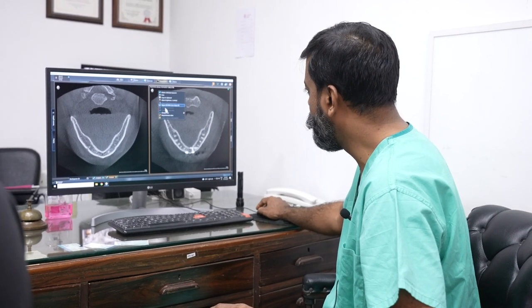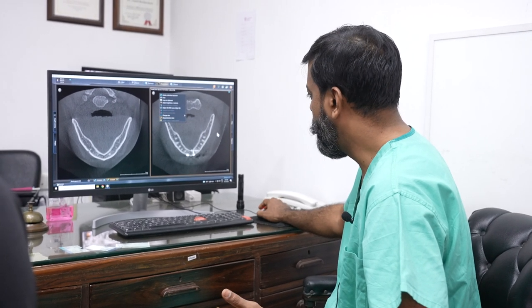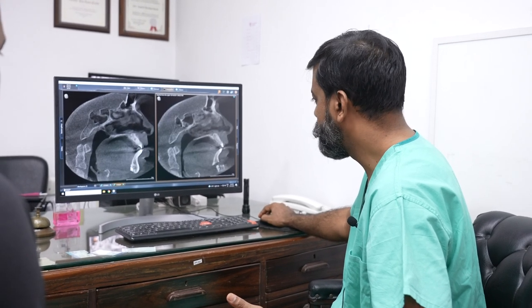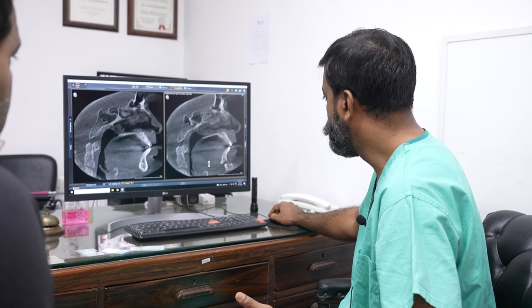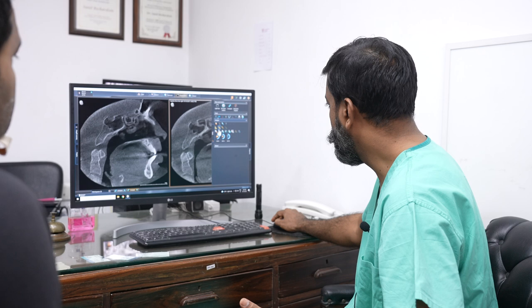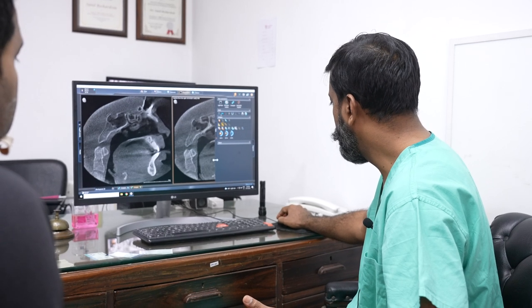Now let's move on. I can show you from more views so you have a better idea. Similar thing here — the cut, and once again we can measure here.